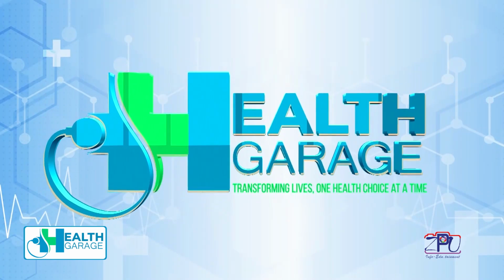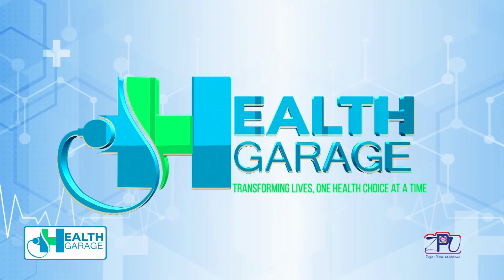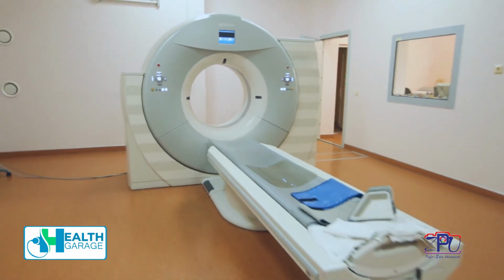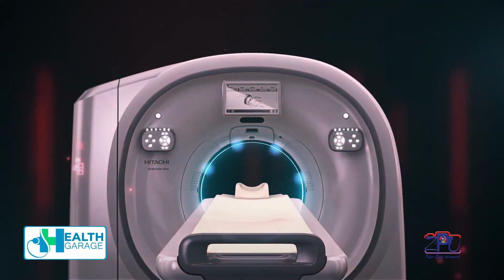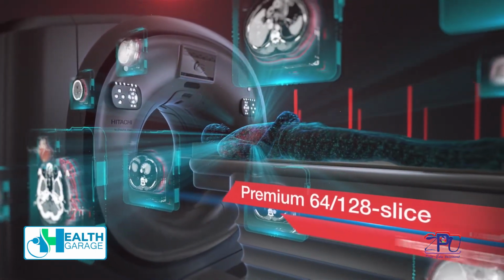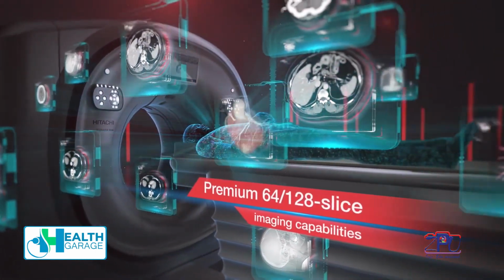Welcome to Health Garage. Today, we are diving into the world of medical imaging, exploring the transformative power of CT scans in solving medical mysteries. Join us as we uncover the benefits, applications, and cutting-edge advancements in CT scan technology with an expert from Uganda Martyrs Hospital Lubaga. Welcome to the show, Doctor, and kindly introduce yourself.